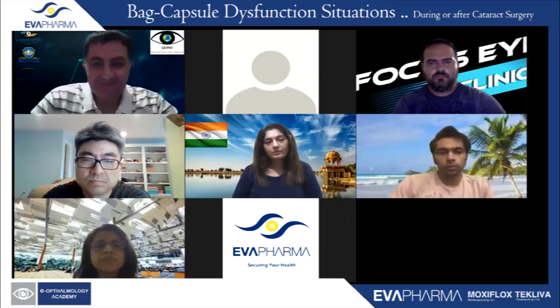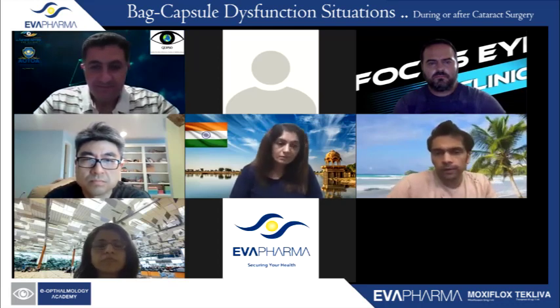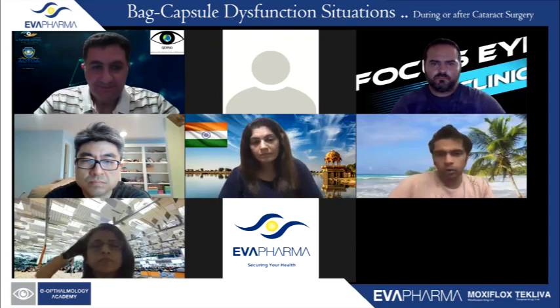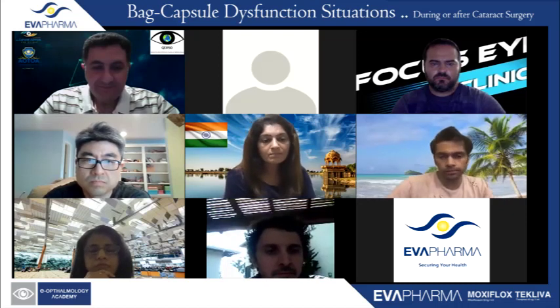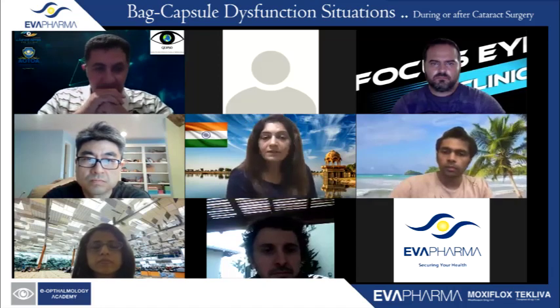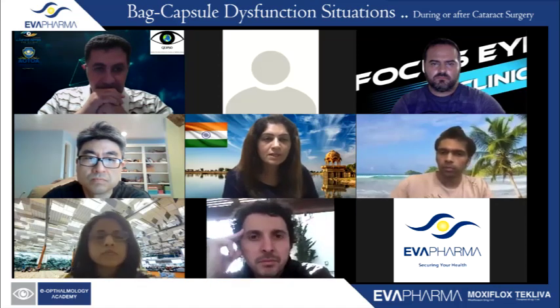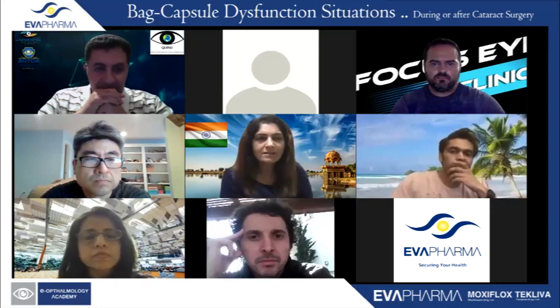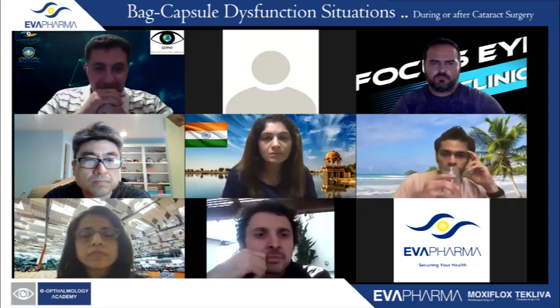Totally agree. Priya, Sergio, I'd like to ask your comment on the anterior vitrectomy or pars plana vitrectomy. I mean, we all might get a small tear or a small PCR. Any comments on that? What is it that you do? Well, for me, if it is a very small thing, like what Ashraf had in the second case, where a little bag had just come up, then a localized anterior vitrectomy would work, and then you would just inflate the bag and it goes into position.